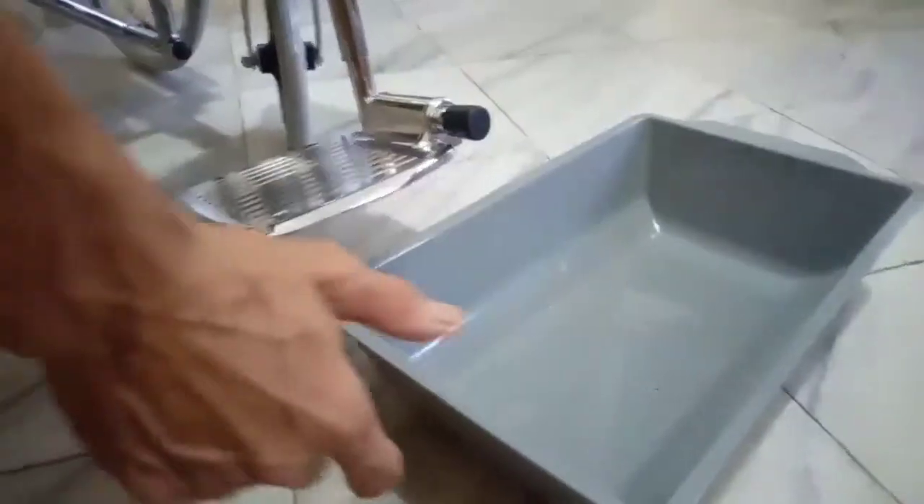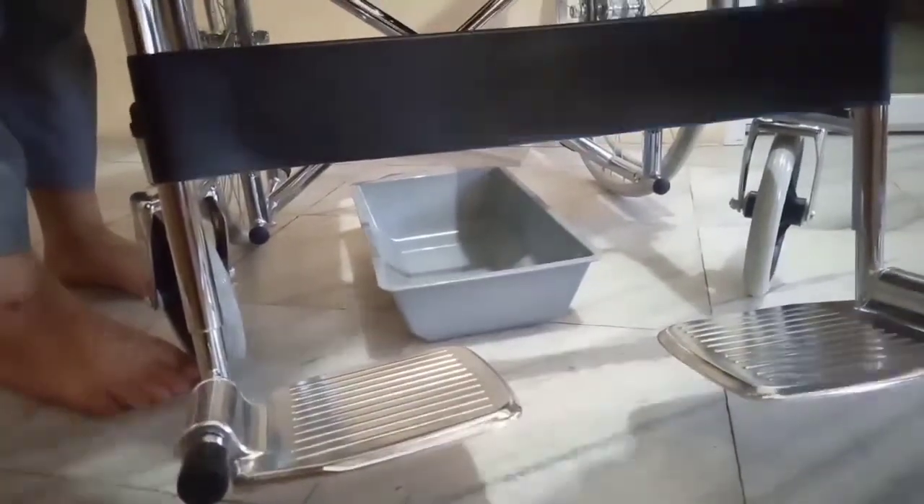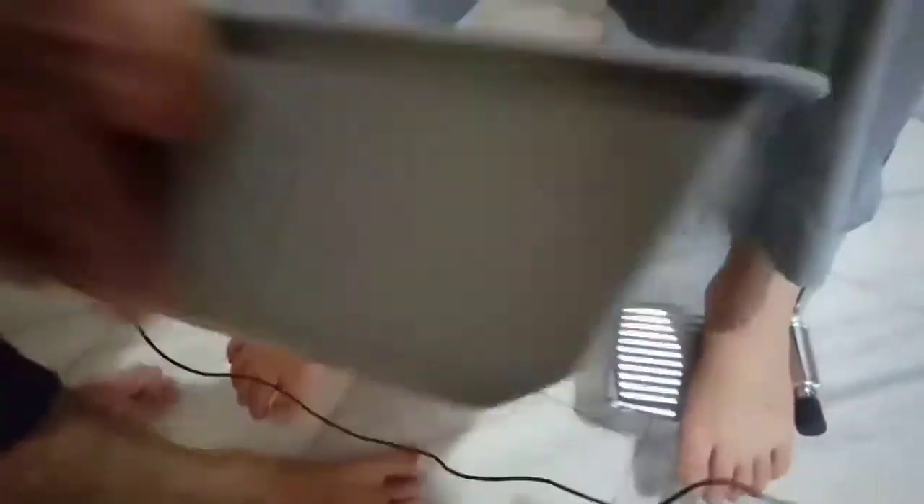Nah ini misalnya kemudian ini pembatasnya ya. Ini bagian pembatas kaki. Dan kemudian ini kita pasang tempat embernya atau tempat kotorannya ya. Nah di sini, nah ini tutupnya. Di sini, nah kita buka. Nah posisinya kayak gini. Jadi ini kursi roda 2-in-1 ini bisa buat berjalan ke mana-mana, bantu jalan, dan juga buat BAB ini ya.